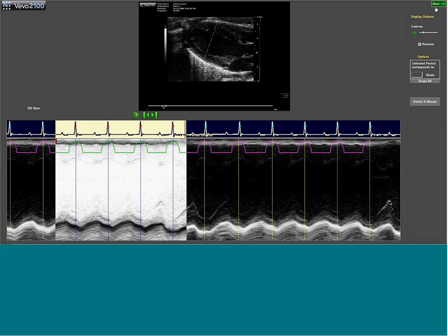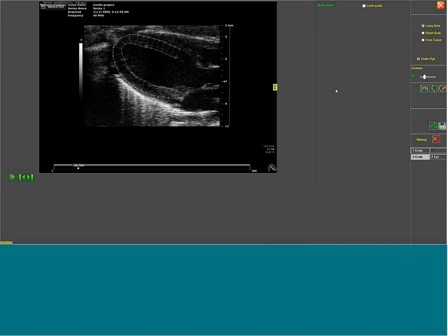So when you have the segment selected, that your trace, this is a long axis. We're going to do endocardial and epicardial tracing at the same time. I do not recommend tracing going beyond roughly about this point, because beyond here you're getting into the area where you're bumping up against the RVOT and the pulmonary, and the motion here in this thinner septum area tends to be a little bit different. And the same down here, you're getting close to, depending on your view, the atria and the mitral valve down here. So try to keep your tracing a little bit shorter.